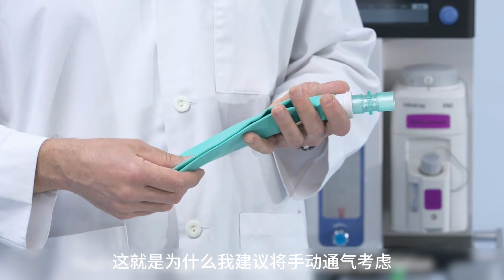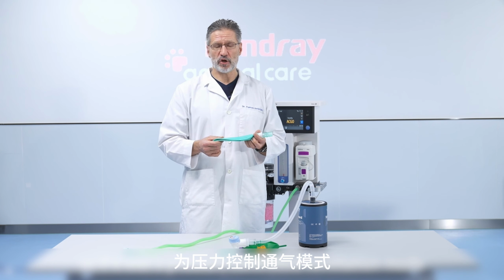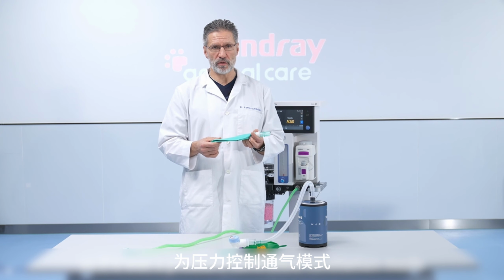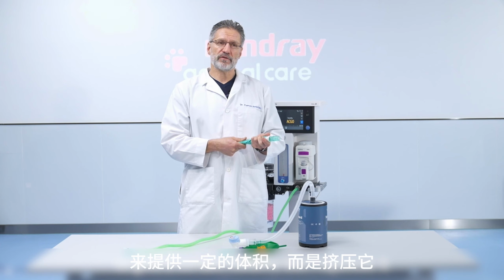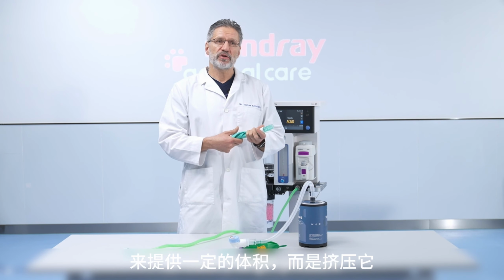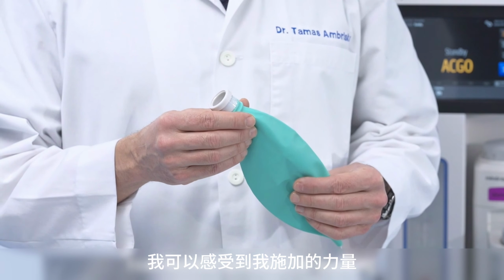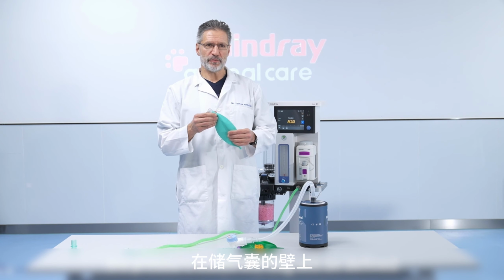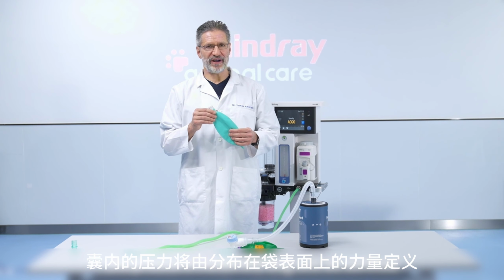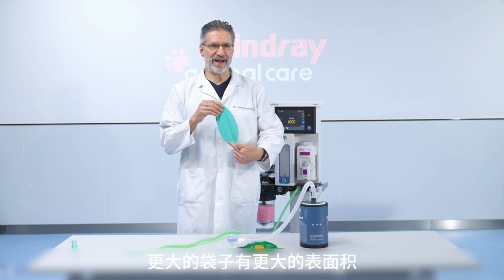That's why I suggest considering manual ventilation as if it was a pressure controlled ventilation mode. So I don't squeeze it to give a certain volume, but I squeeze it to reach a target pressure. I can feel the force that I'm applying on the wall of the breathing bag. The pressure inside the bag will be defined by the force distributed over the surface of the bag.